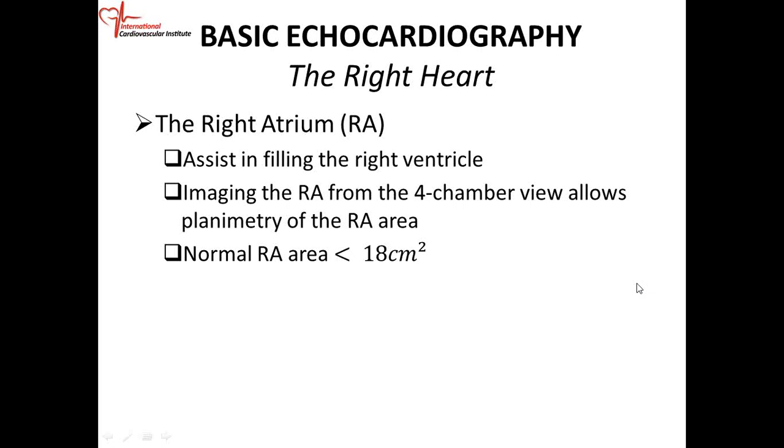The definition of RIMP, if you remember, is tricuspid valve closure to tricuspid valve opening minus ejection time, divided by ejection time. When you simplify that, we get IVCT plus IVRT divided by the ejection time. And then we said that anything greater than 0.4 is abnormal.